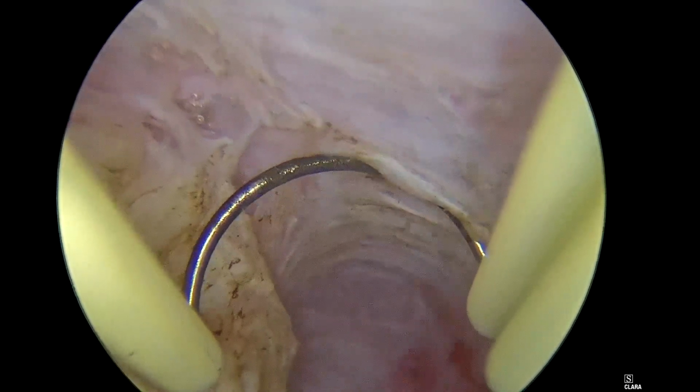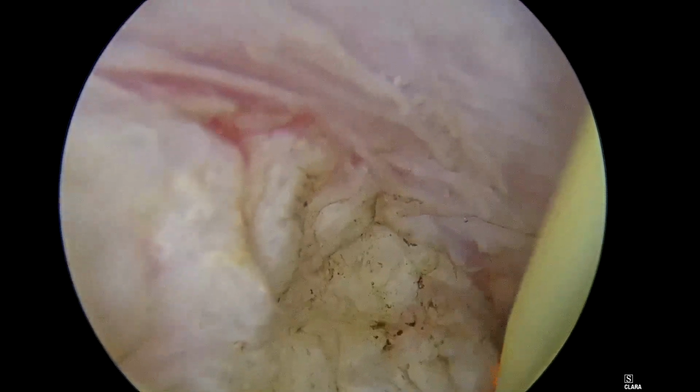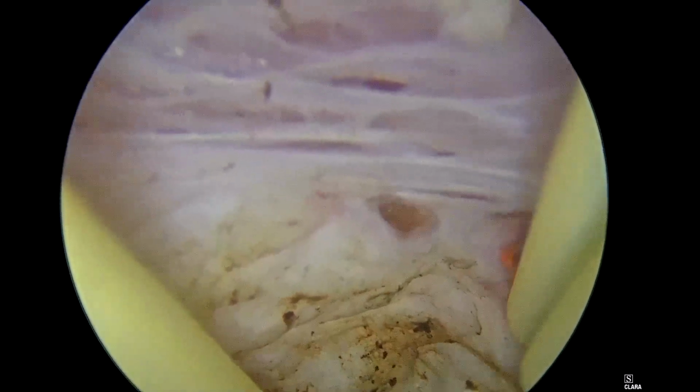Again, another bleeder. But still, I was not worried or aware that there was suction of gas bubbles through this open vascular channel. Working with a little higher pressure that exceeds the vascular pressure goes against the mainstream teaching that high pressure will cause fluid overload.